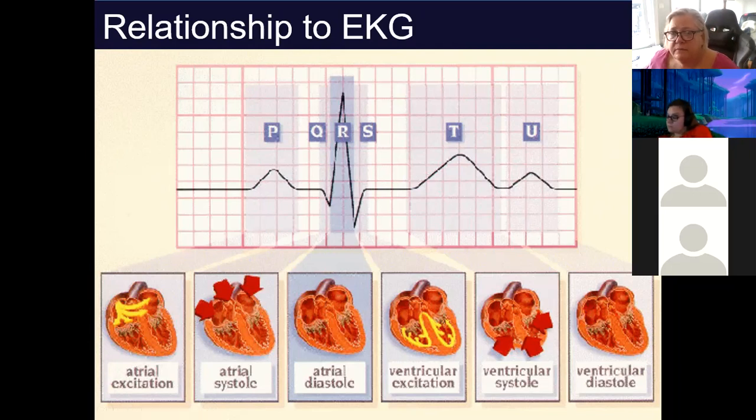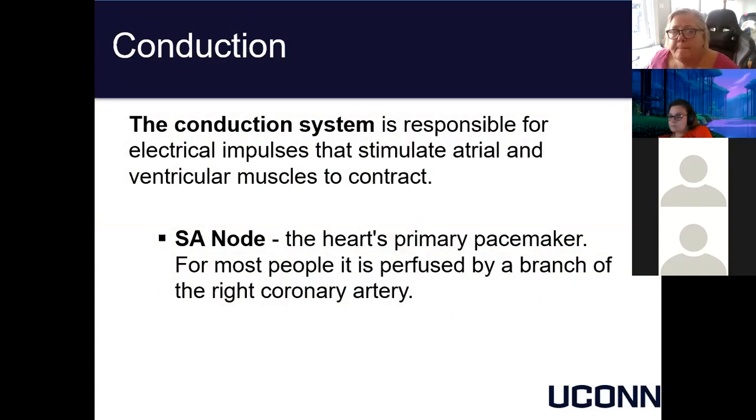Question. I always learned that EKGs only show the electrical activity. They don't actually show the physical contraction or relaxation. So is it just sort of implied that the systole and diastole is happening at that time? That's correct, Robin.